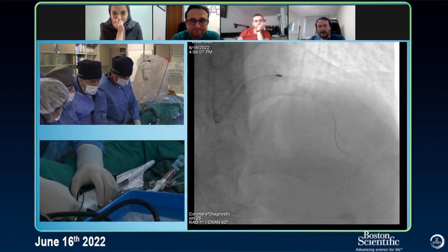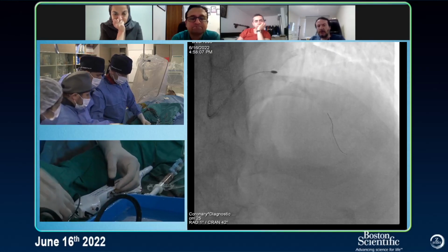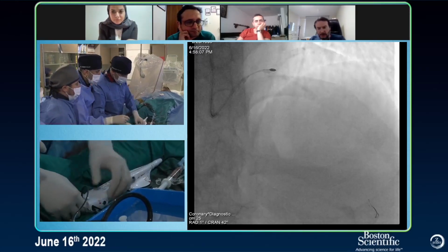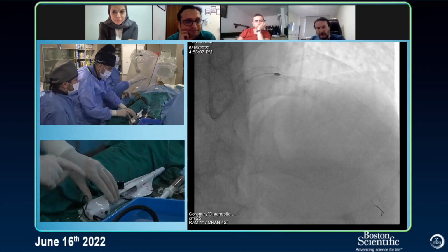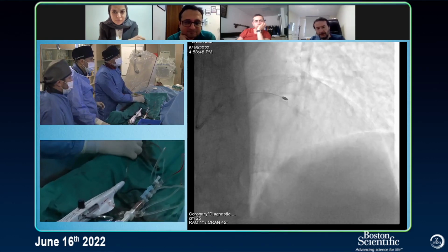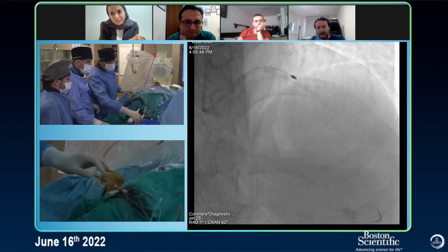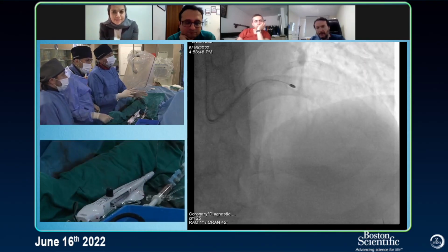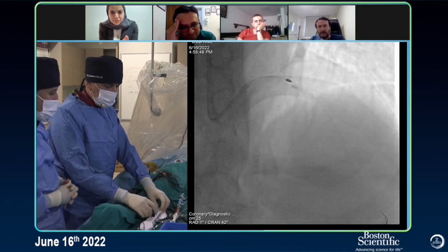That's one of the reasons why I always use a microcatheter to deeply insert the rota wire. The rota wire should be as deep as possible. I will insert it a little bit more with the help of the Dyna. That's a good trick. Anyway, let's push a little bit forward. I will start from here again. Each run has to be 15 seconds. Our pressure is okay. We can give some fluid.